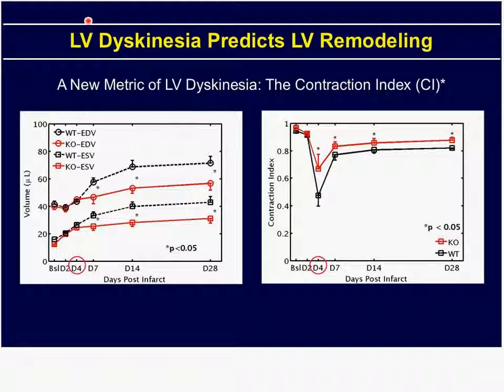But I might point out that with the motorized stage and with the right programming, one could essentially get a 0.5 millimeter incremental stack in essentially the same period of time that you would spend getting a conventional B-mode stack of B-mode images.